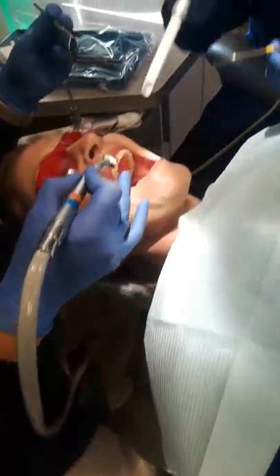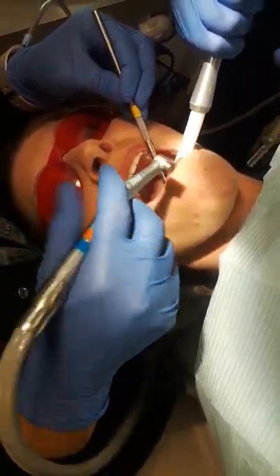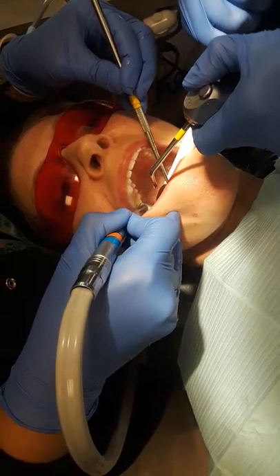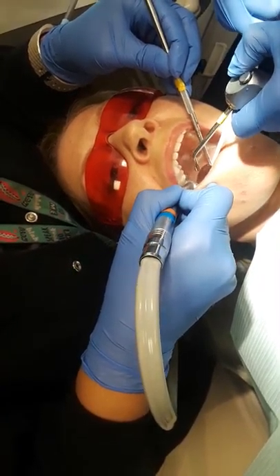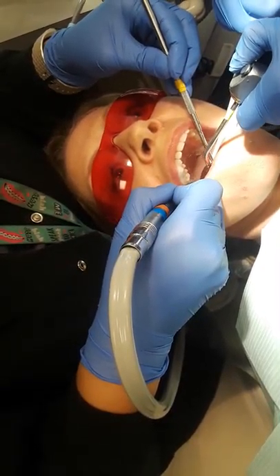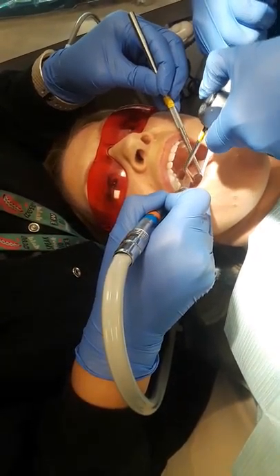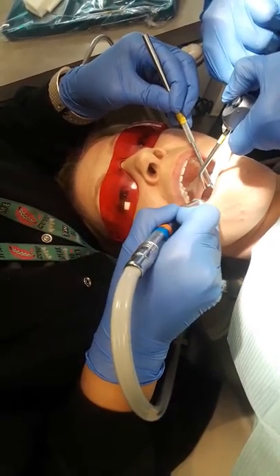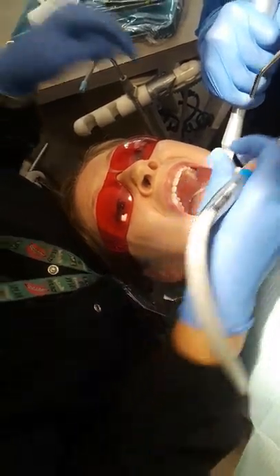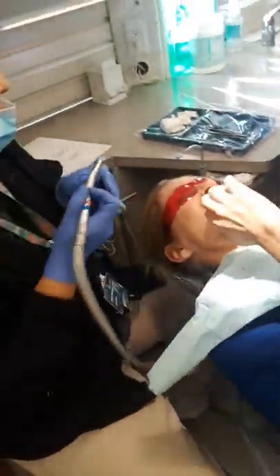That means you're in. We'll focus the back like that. Put it in from the water, from the air. Make sure I can see because you're not blowing on my mirror. There are so many things you can suction, so you've got to pay attention to my mirror, especially out there on the maxillary. If I stop, you stay and get all the water, both sides, and then come out. That's kind of hard, isn't it? And you have to stay still.